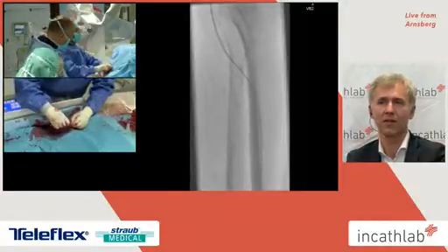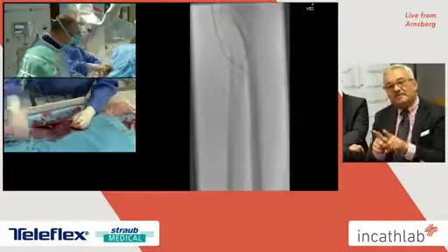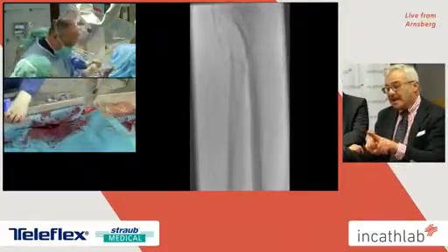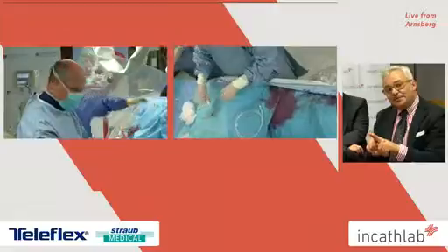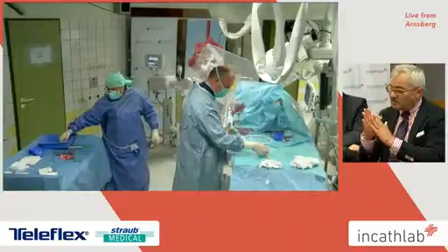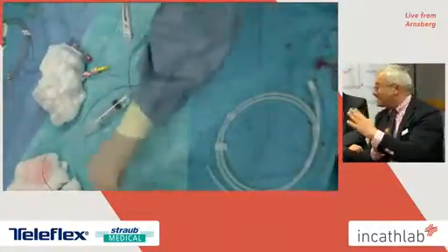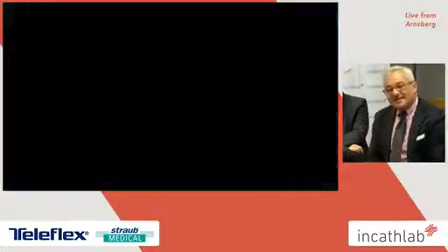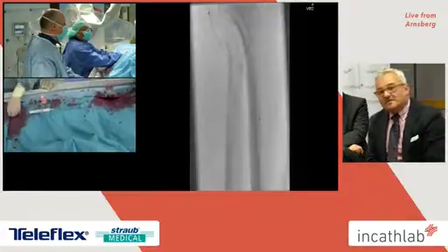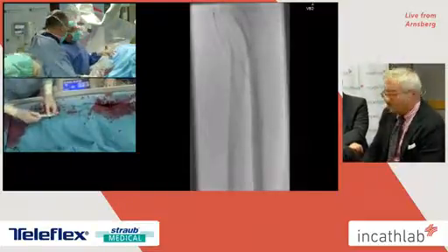Yes, the same we did here, with two wires in order to divide the vessel. The problem is when you are subintimal, sometimes you may have two different doors at different levels. So when you dilate, there is a flap in the middle, and you may save just one vessel of the two. So the other option, Michael, what do you think about the reconstruction of the bifurcation?